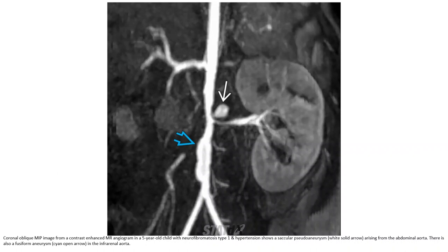MIP image from a contrast-enhanced MR angiogram in a five-year-old child with neurofibromatosis type 1 and hypertension shows a saccular aneurysm arising from the abdominal aorta. This also shows a fusiform aneurysm in the infrarenal aorta.